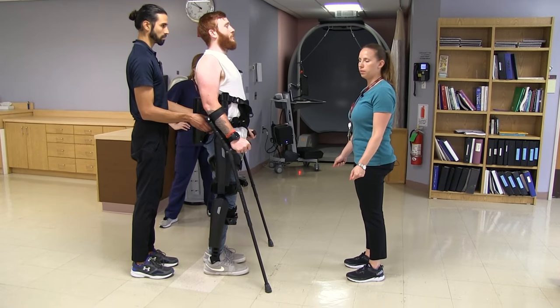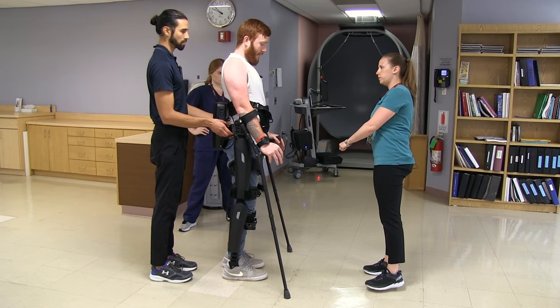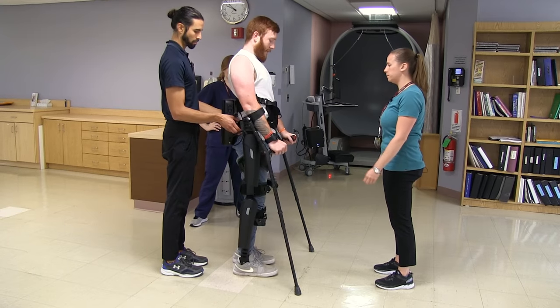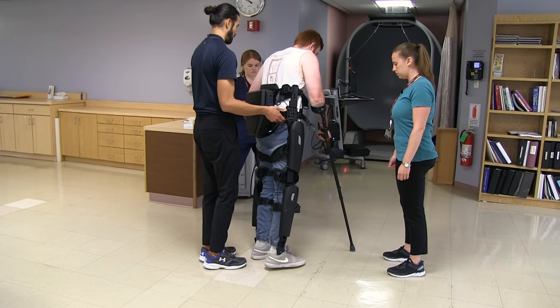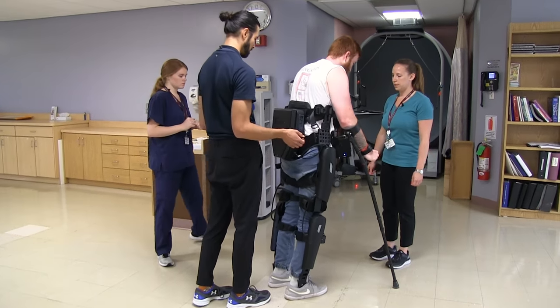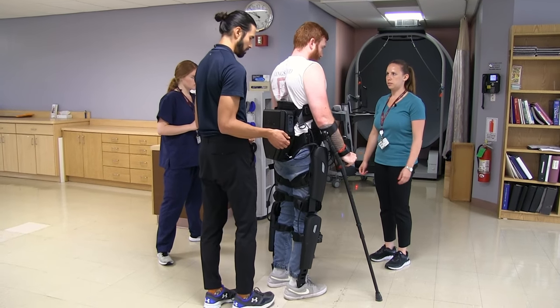To turn, Keith is going to bring both crutches to the side, weight shift to offset one of his legs, and then use the crutches to pivot and turn. The therapist cues him to go a little faster and take it more on his heel — only shifting as little as needed to lift up the opposite leg.